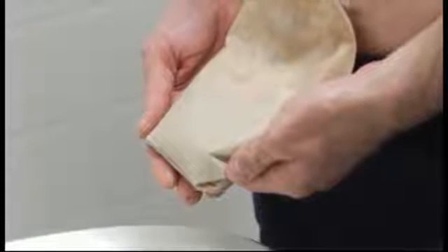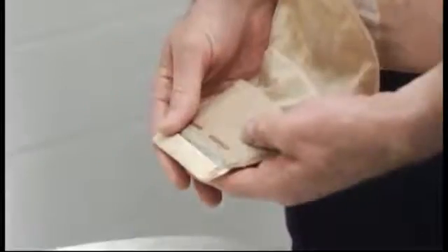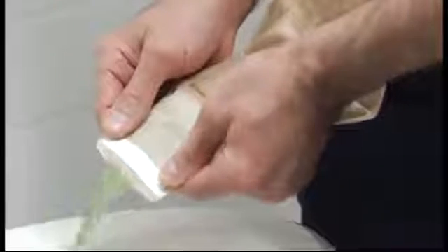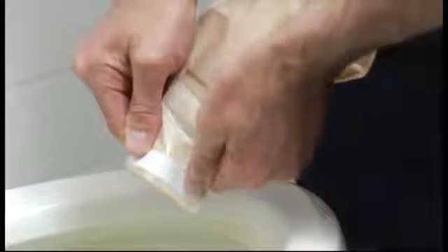To drain the pouch, make sure to be near a toilet or other receptacle and have tissues on hand for cleanup. Unfold the tail from the locket pocket as shown, and while positioning the pouch over the toilet, disengage the closures and unroll the tail. Hold the tail up as you unroll it. This will give you more control.